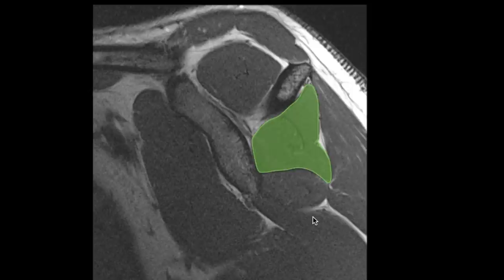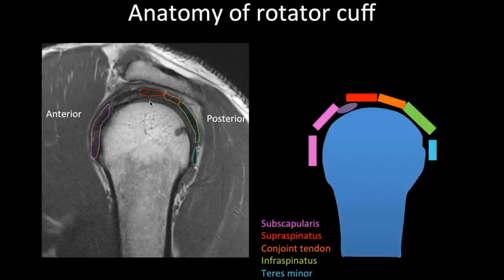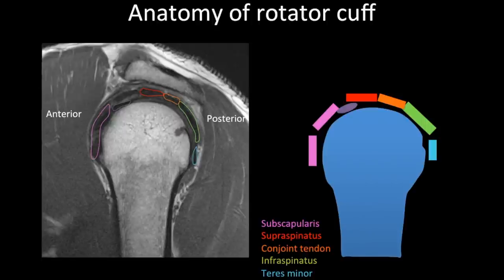The superior one is infraspinatus and the inferior one is teres minor muscle. When you come laterally you start to see the humeral head with the rotator cuff tendons around it. At approximately the 12 o'clock position you have the supraspinatus tendon and the conjoined tendon. Anteriorly is the subscapularis tendon. Anterosuperiorly is the biceps tendon abutting the humeral head, and the infraspinatus tendon and teres minor tendon are also visible. Note that subscapularis is a multipinnate tendon with multiple tendons.